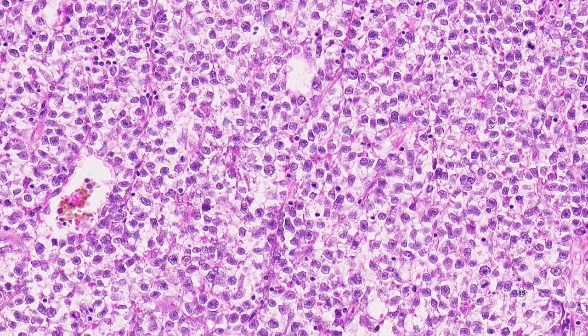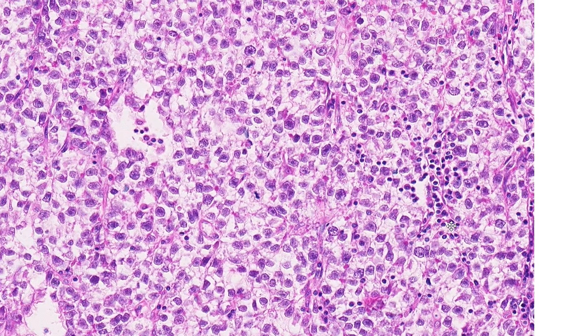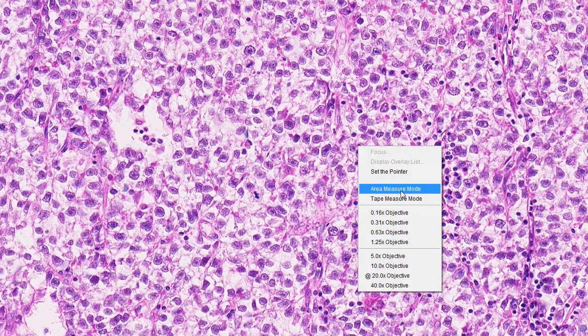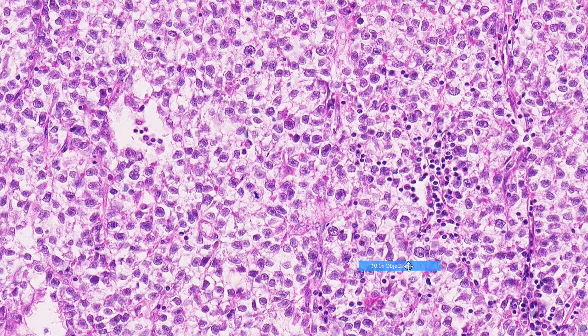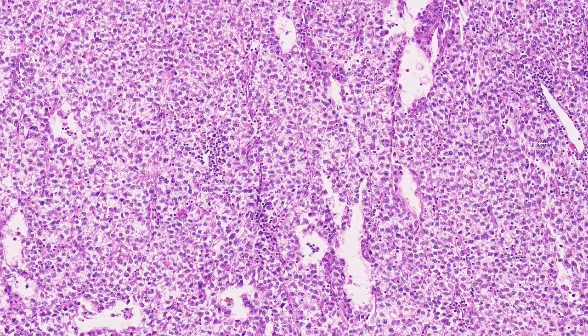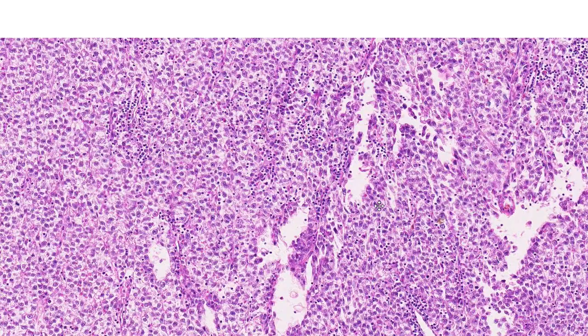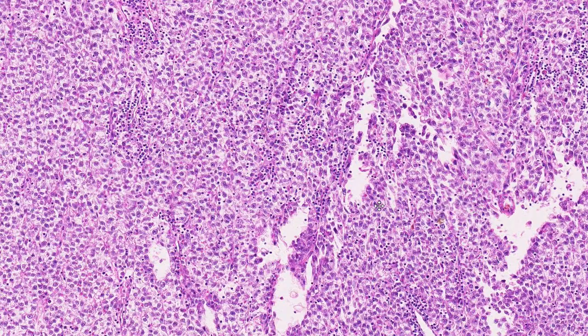In addition, we have some admixed small lymphocytes, but not many. There's not much else to say about the appearance of these cells, and this appearance is relatively a classic appearance for a seminoma.